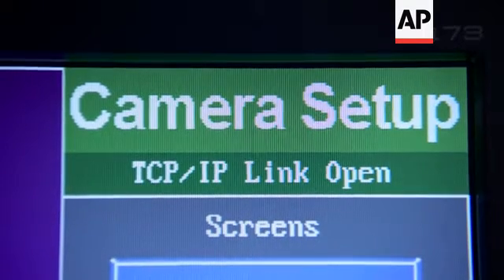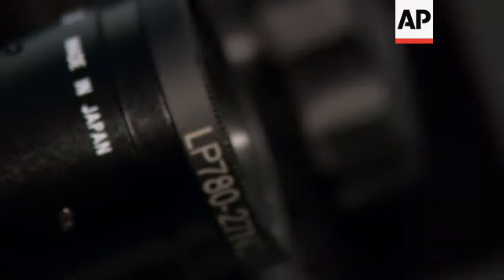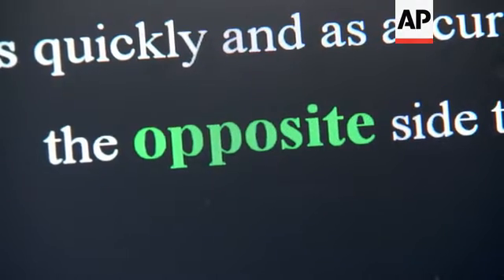If you could fixate on this little red circle whilst it moves around the screen. We find in Alzheimer's disease that, for some reason, patients don't seem to be aware of the errors that they're making — so they get distracted and they fail to correct for that distraction. You're supposed to look at the opposite side of the screen now.